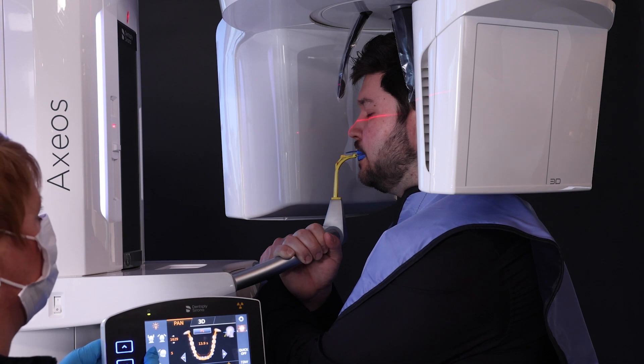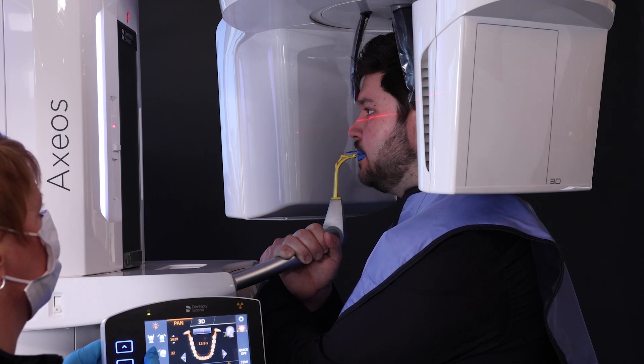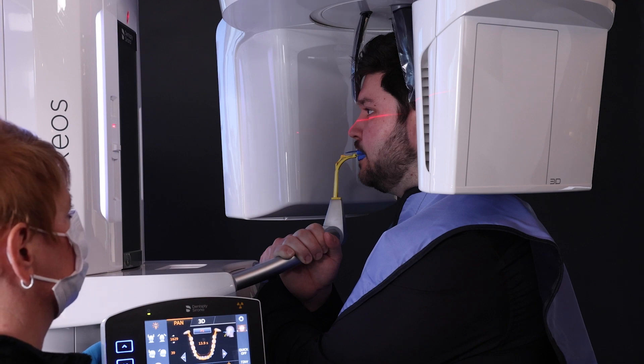Then close the temple and forehead supports appropriately. Hold the exposure button until three beeps are heard.